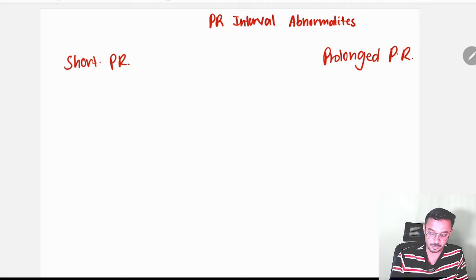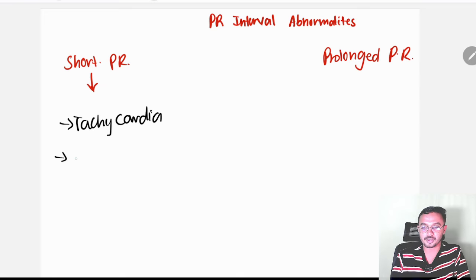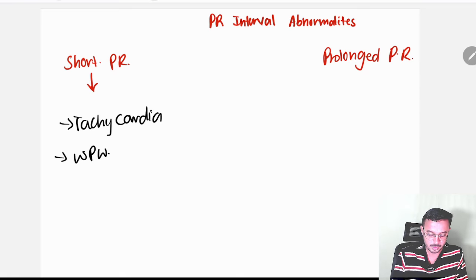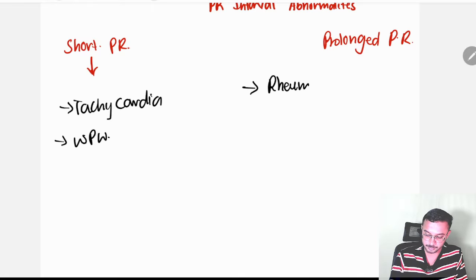Short PR you are going to see in tachycardia, and I taught you short PR in WPW. Prolonged PR you are going to see in rheumatic fever.